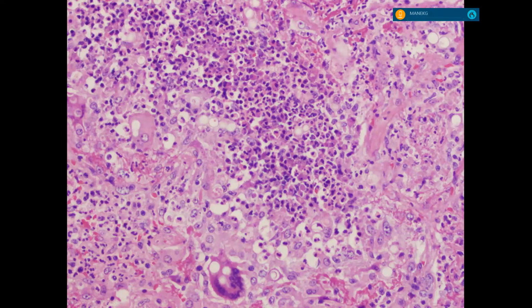A 56-year-old woodworker from Wisconsin comes down with a fever and has a large right upper lobe consolidation with an air bronchogram in the middle, suspicious for malignancy. Rule out malignancy, and then a biopsy was performed. I don't see anything broad-based or budding, but the area is quite damning for blasto. Yes, correct. Actually, this thing is a broad-based bud. See that this is the daughter, this is the mother, and then this base is broad. So it's tricky, it's not that easy to see. There's another one here, mother, daughter, and a broad base in between.